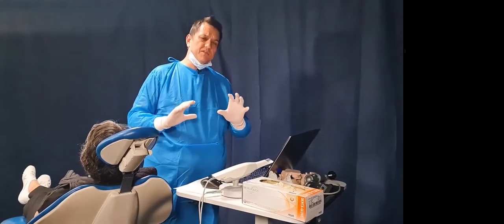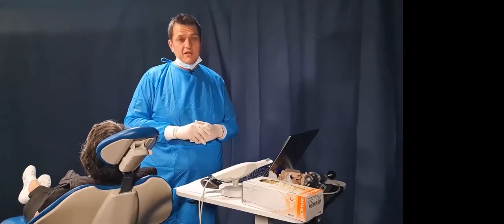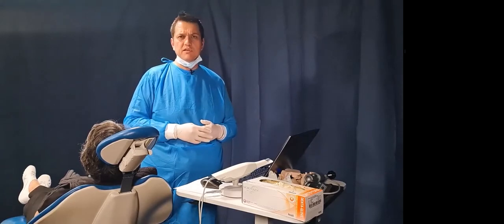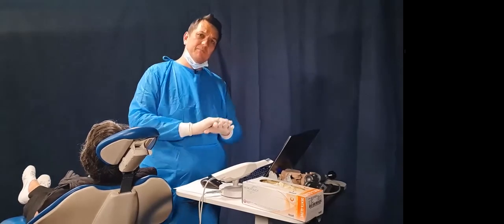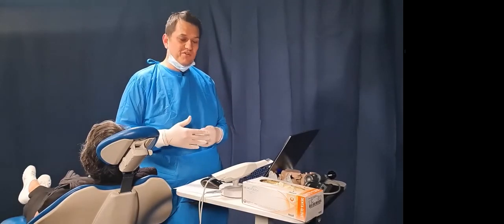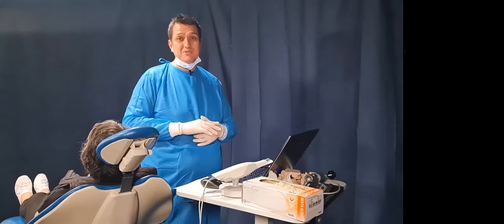We're going to do two things. We're going to firstly just do a full upper edentulous arch scan. We're going to have a look at that, and I'll give you some tips and tricks, some finger positions to help you do that as well. Hopefully I do some things that aren't a bit weird and wonky. Sometimes you'll get overstitching in the palate. So if I do that, it'll be a good lesson for you, and we can go back and work together on how we can avoid that as well. But it's quite a good exercise to do together.